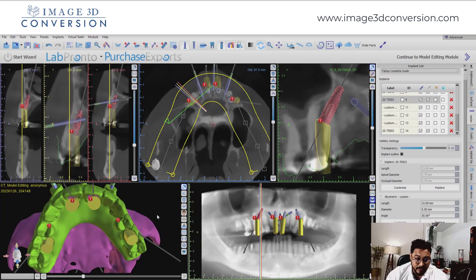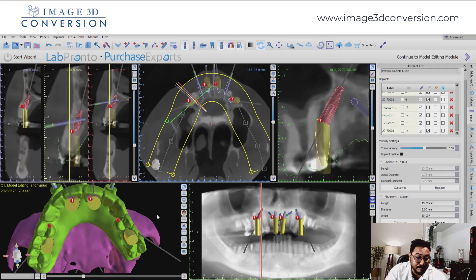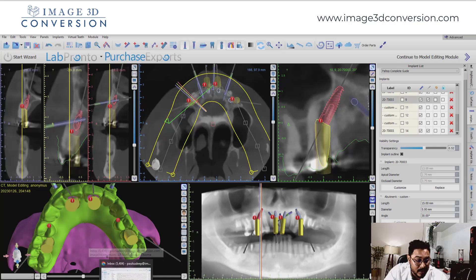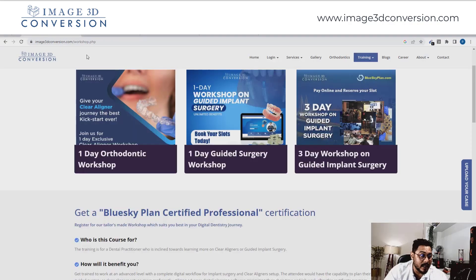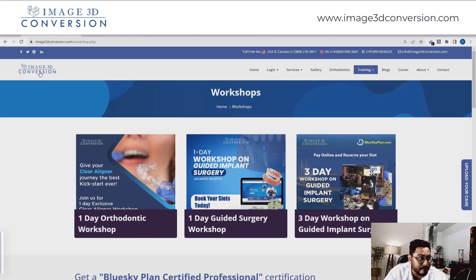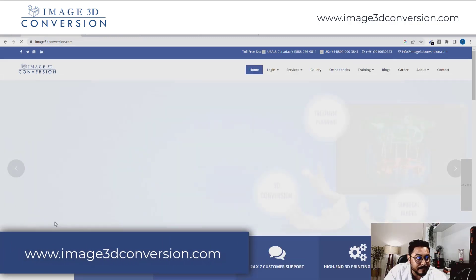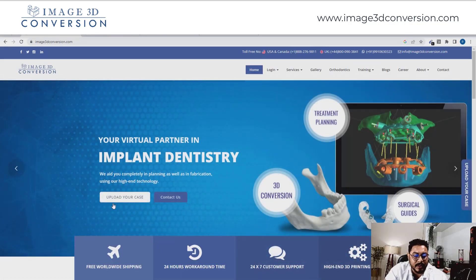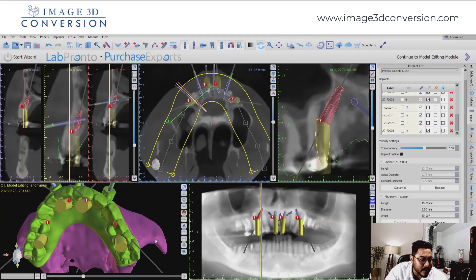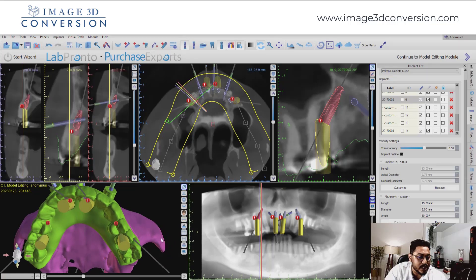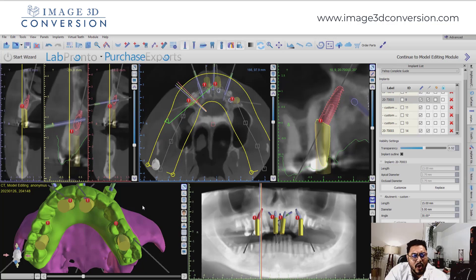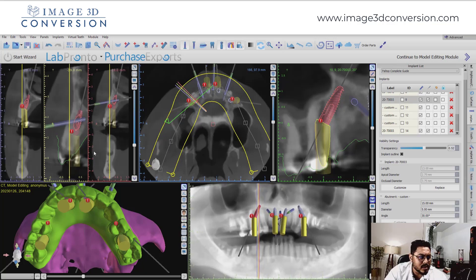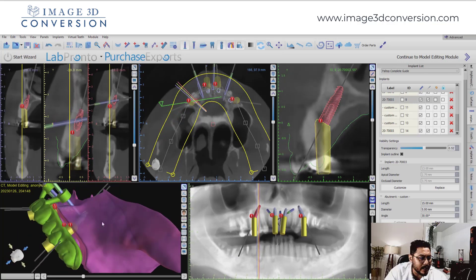So this is what you need to consider in treatment planning review — whether you are getting guided surgery planning from image 3D conversion or from any company you are partnered with. If you receive a treatment planning file from a company and need to review it the right way, this is why I came up with this video. Pan view, sagittal view, tangential view, and 3D view are your one-stop solution to stay confident.